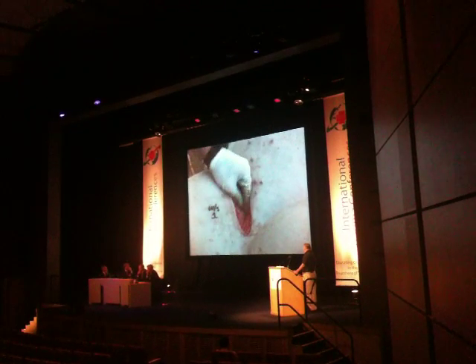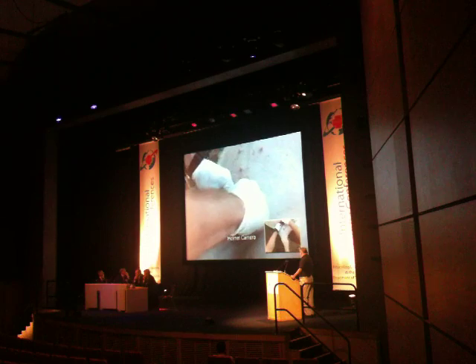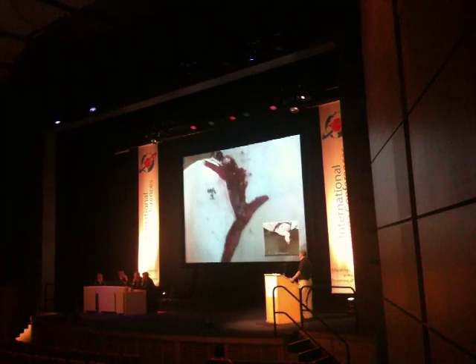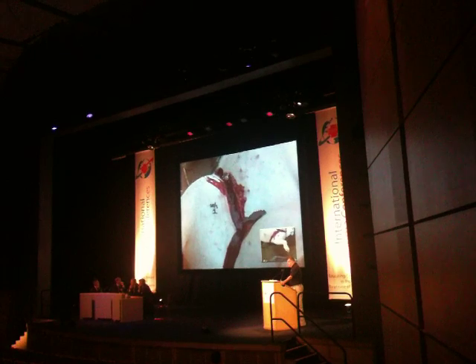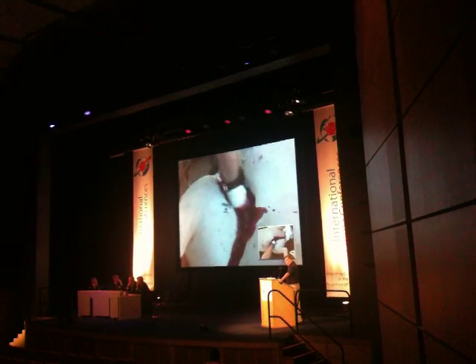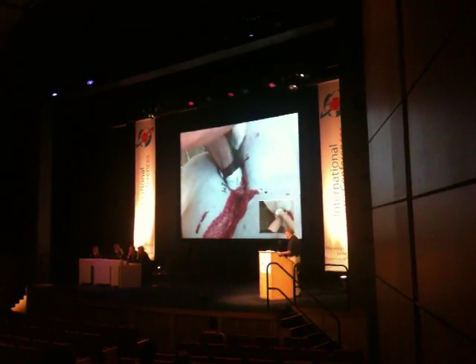Test number one: the femoral artery is severed, and there is approximately a 10-second high-pressure bleed. This is the worst possible scenario where the artery as well as the veins are severed within the muscle body — not dissected free, but within the muscle body — which makes it particularly difficult to control.